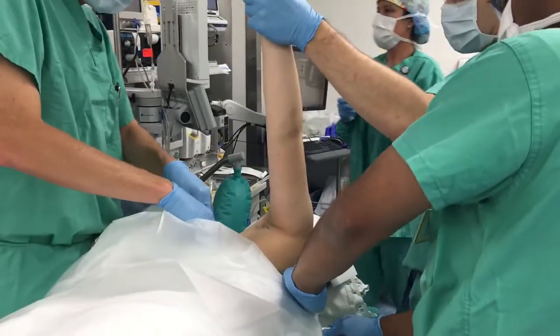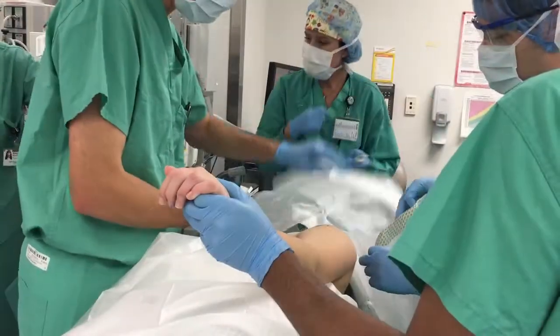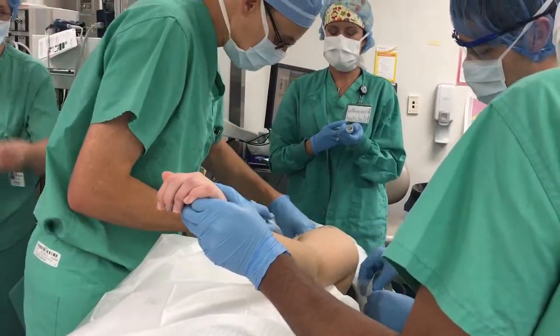The lower body is covered with a bear hugger and blanket to maintain the patient's body temperature during the procedure. To isolate the operative extremity, two clear U-drapes are placed around the surgical area.